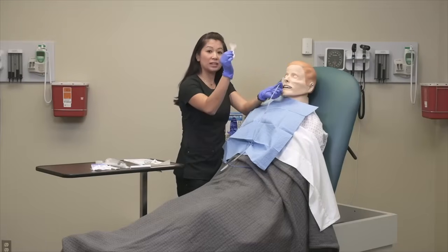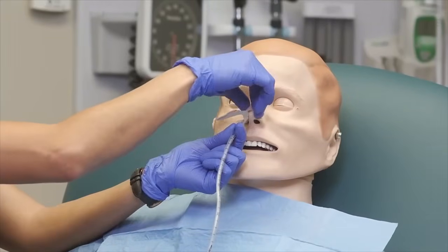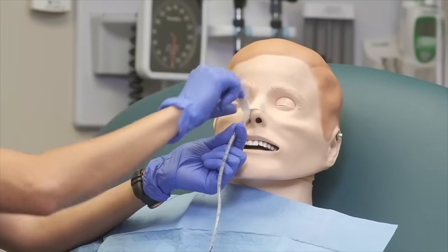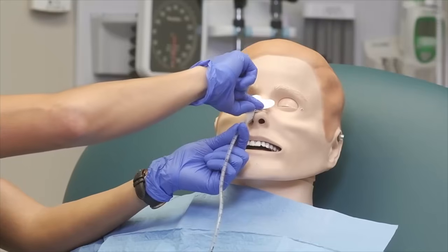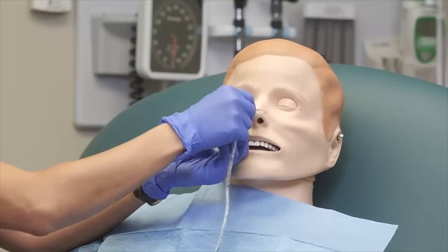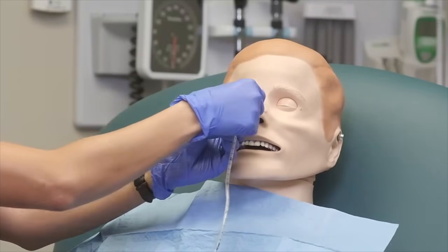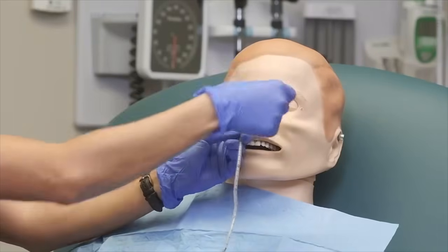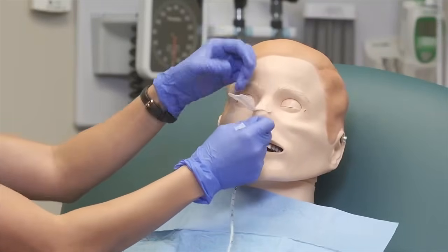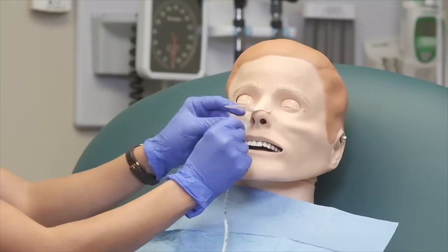This is where the securement strip comes in. The little heart is going to go around their nose. Take off the securement strip and my measuring tape. Notice the whole time I'm doing this, I've not let go of the nasogastric tube, because I don't want to lose placement.